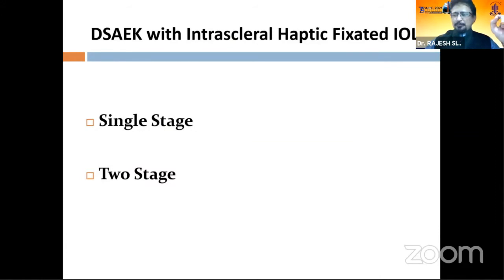Now, the point is that if you are doing an ultra-thin DSEK or any endothelial procedure as a single stage, what we found out is that sometimes you have to do iris manipulation as well, because these are complicated scenarios. You have to do something like pupilloplasty, whether you use a single pass 4-throw pupilloplasty or any other technique. Then the risk of inflammation is high in the post-op period. So the risk of damage to the host endothelium and donor endothelium is there.